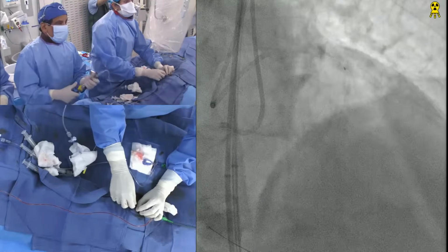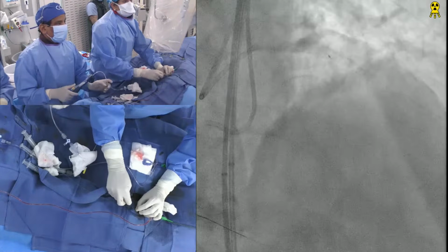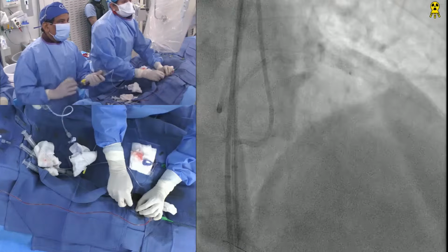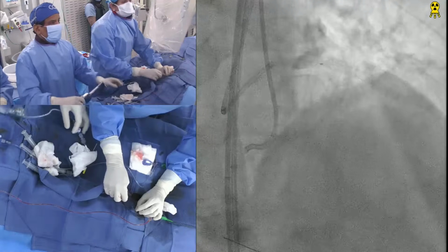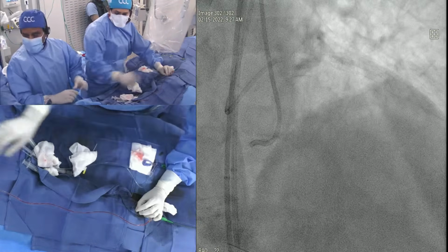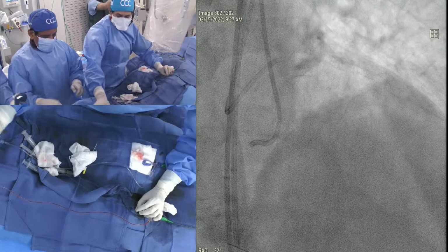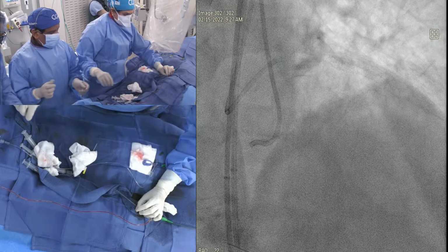Okay, this is the 1.0 balloon. Sapphire, don't go more than 12, it ruptures otherwise. Very good balloon, but if you go more than 12, it's trouble. Ruptured already. Sometimes it's a good thing to rupture. Okay, 12 now. Get a 2.0 by 12 balloon back. Good. Wait.